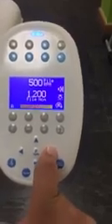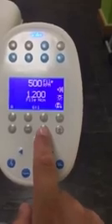So if I go back into the menu again with a plus or minus, use the chair position arrows to move myself back down and then across here. If I adjust this again, we'll now have an arrow pointing backwards. This means I'm in the auto reverse mode. So now you will get a warning beep as the file approaches 1.2 Newton centimetres of torque. It will then beep twice when it hits 1.2 Newton centimetres of torque, and it will then stop and automatically reverse out.